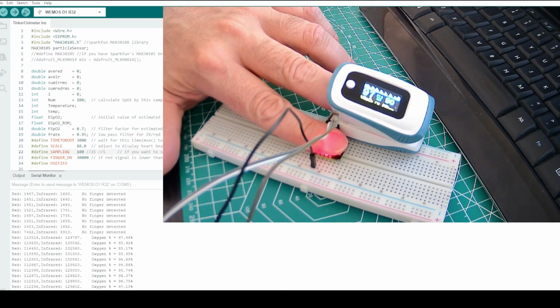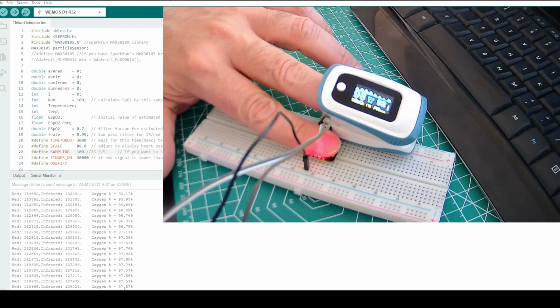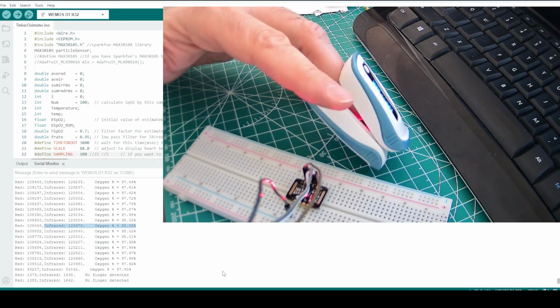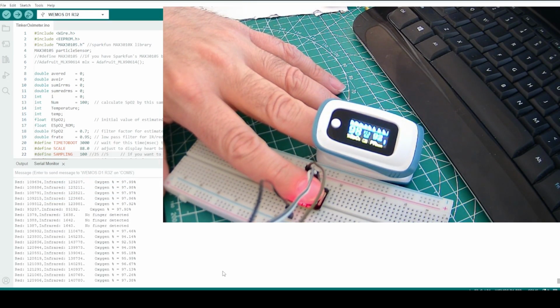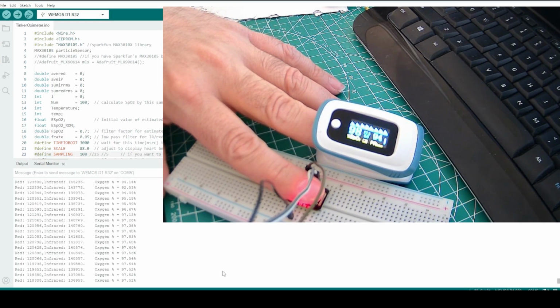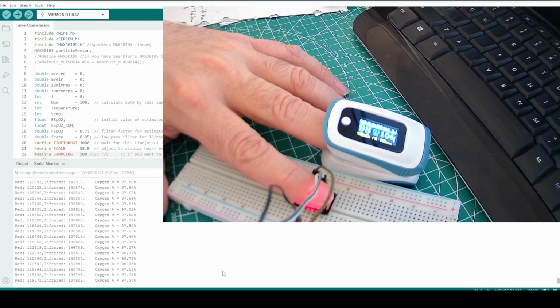But you can see oxygen saturation levels about 98% that match with the reference device. If I take my finger off the device, it reports no finger detected. And once I put my finger back on the device, it detects it and starts reporting values again. Again, taking some time for it to reach the correct value.